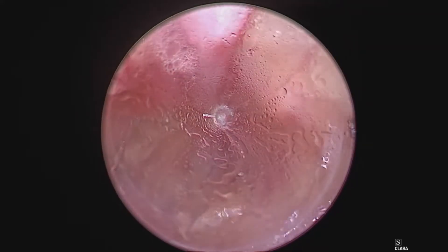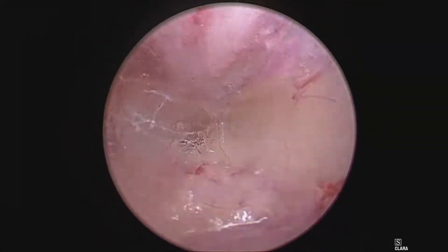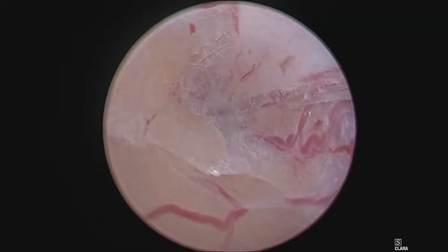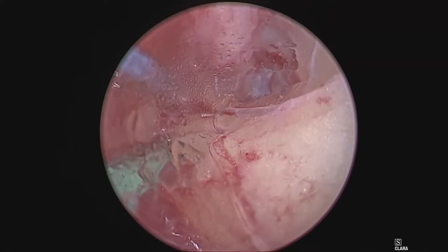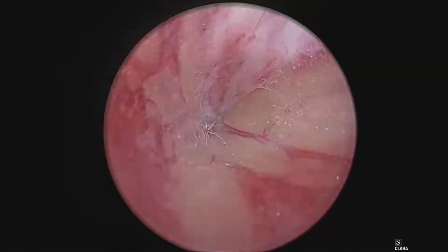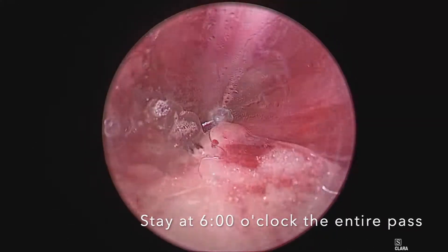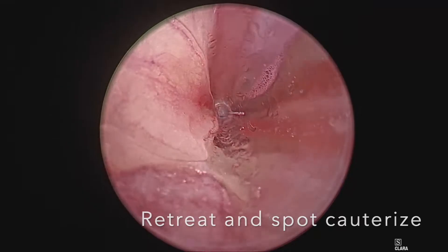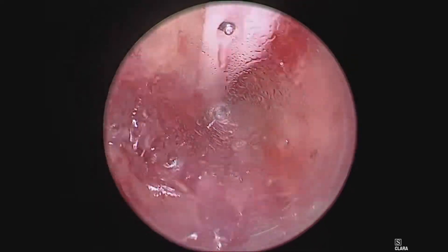If necessary, you can circumferentially dissect at the beginning to help pop open the tunnel. During the posterior pass, I will retreat and identify any small bleeders and cauterize to keep my tunnel dry and my vision clear. If any moisture collects on the conical tip, an efficient way to address this is to just do more dissection into fresh tissue. That will clear your conical tip and do dissection at the same time. You always want to stay at 6 o'clock during this pass, retreat, identify any small bleeders, and address them. This will maintain a clear view and a dry tunnel.